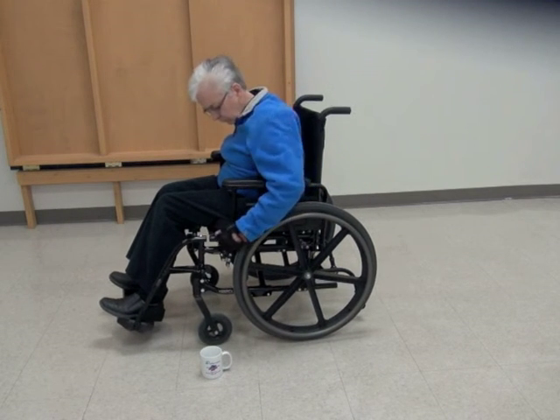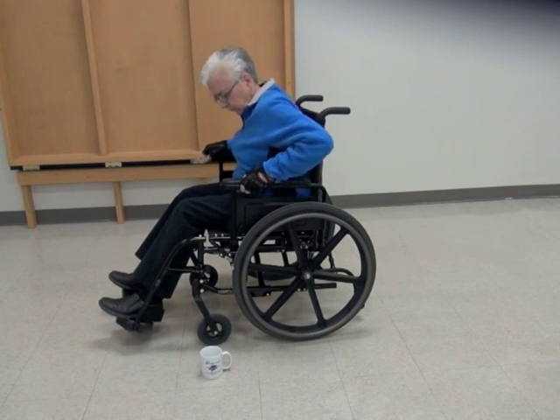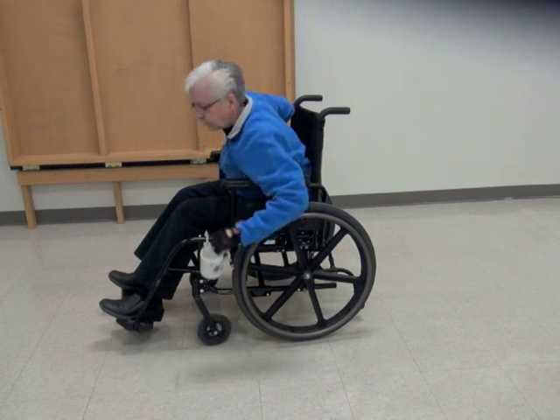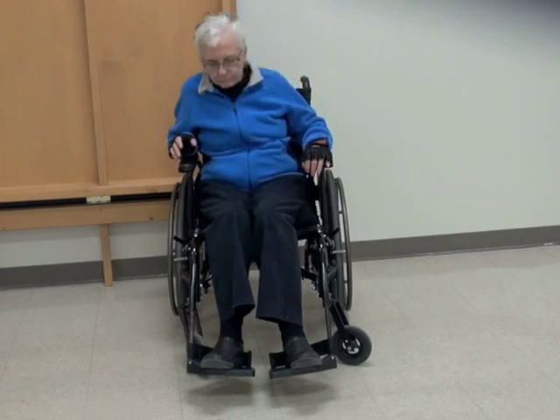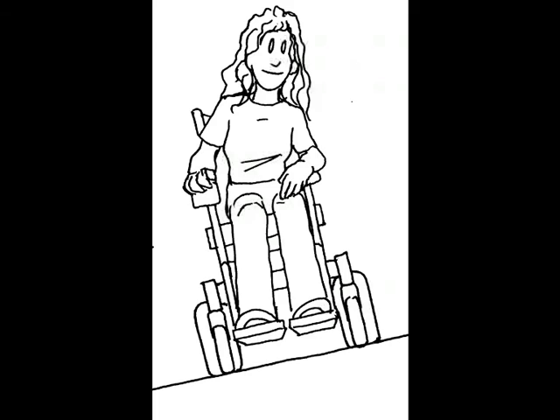When you want to reach an object like a doorknob or retrieving something from the floor, leaning to the side can get you closer. Leaning sideways can be useful when you want to change sitting position in the wheelchair or reduce pressure over one side of your bum. A third situation where you may want to lean sideways is when you are propelling across a slope and the wheelchair wants to turn sideways. Leaning towards the top of the slope can keep the wheelchair straight.